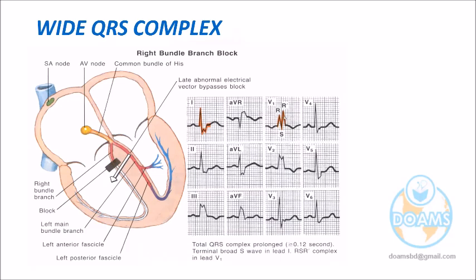It's coming and going. Is it wide or not? The QRS complex seems to be wide. So there is an M pattern in V1 and the reverse pattern is the reciprocal change. What will be the reciprocal change of M? W. Right. Is it visible in V5 or V6? No, but it is visible in lead 1, because lead 1 is the left-sided lead. So this is the reciprocal change. Wide QRS means block.